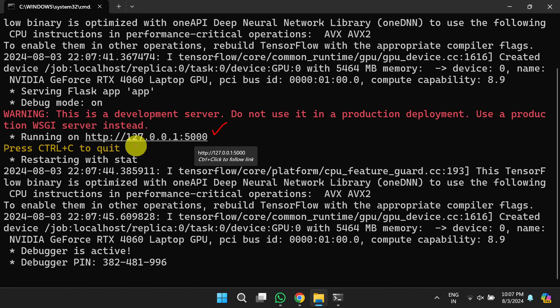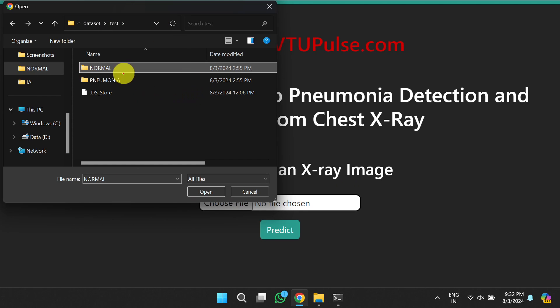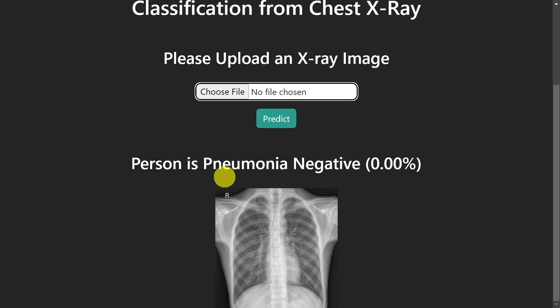Copy the link and paste it into your browser. Once you press Enter, you will get the home page of your app. You can see the project name and it asks you to select an X-ray image. Click on 'Choose File'. I will select a few images from the normal folder and a few from the pneumonia folder. After selecting a normal image and clicking the Predict button, the result shows 'Pneumonia Negative' — it is a normal person's X-ray with zero percent chance of pneumonia.